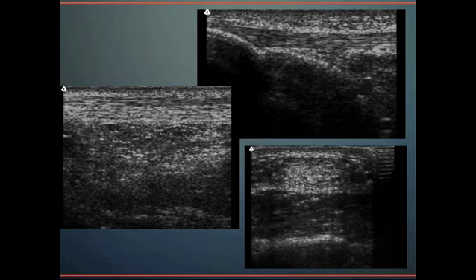This is 3 different regions where we see some tendons. Here's a tendon along here, it exudes that anisotropy or this false hypoechoic area here, and it's very hyperechoic along here. Note the striations. We can see here in the short axis, this tendon appears quite hyperechoic, and then we move it into the long axis, we can see those striations march across the screen again.